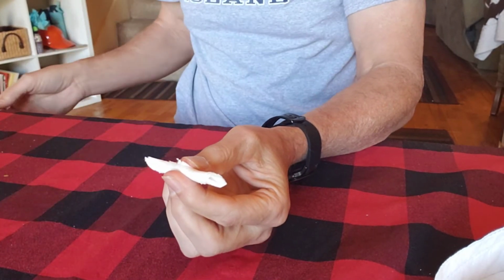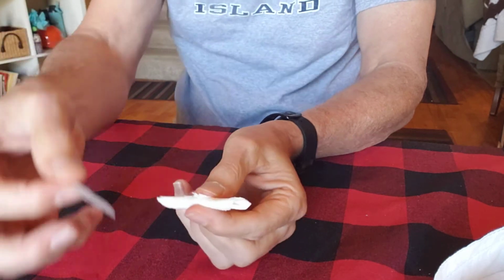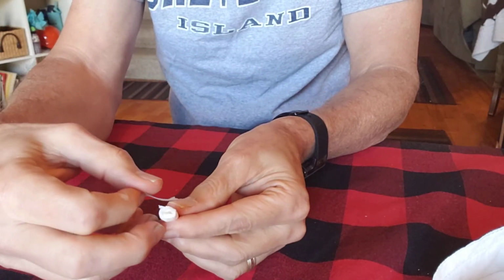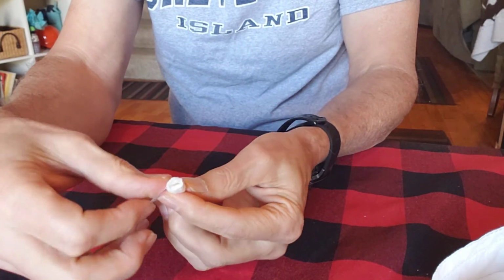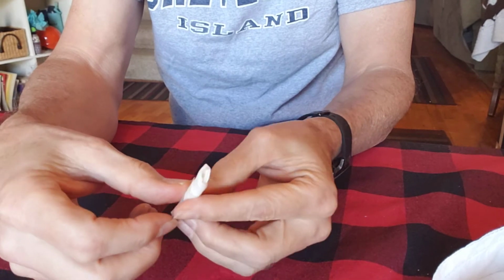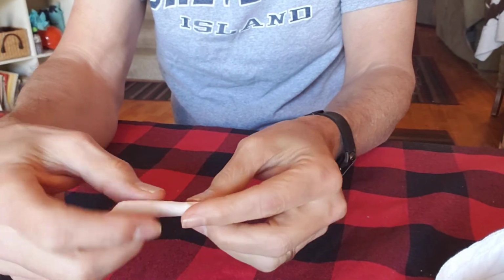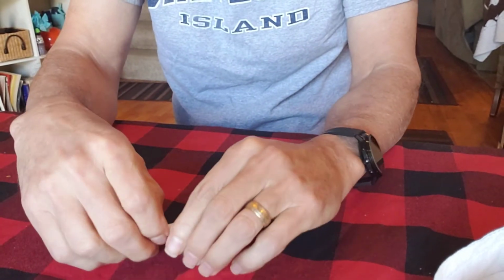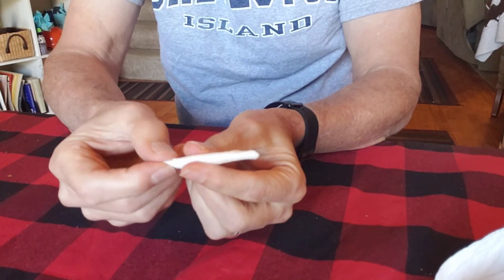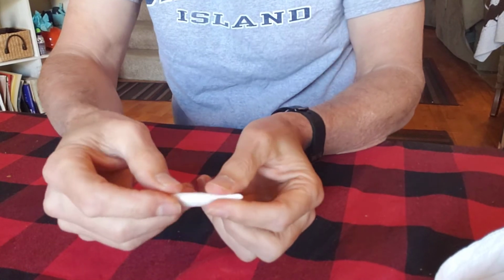And in fact, I also use some tape. I cut my tape like a triangle. So when I finish taping that, I use my triangle tape just so that I don't have a seam on the tape, so that there's not a rapid change in diameter in it. Maybe if I squish it out a little bit, you can see it's a lot thinner on the edges than it is in the center.